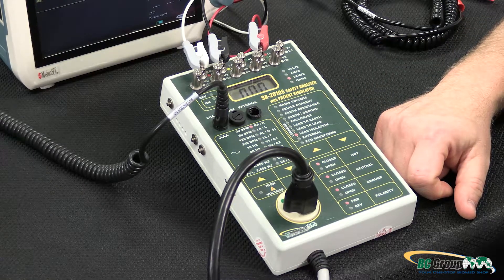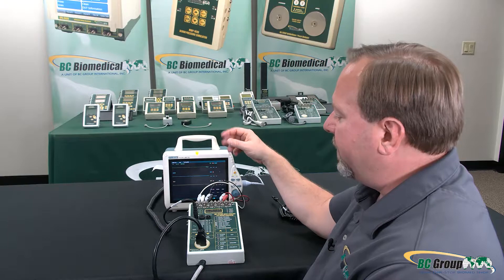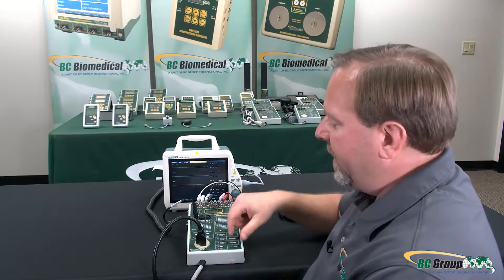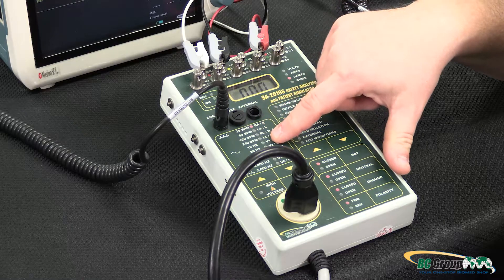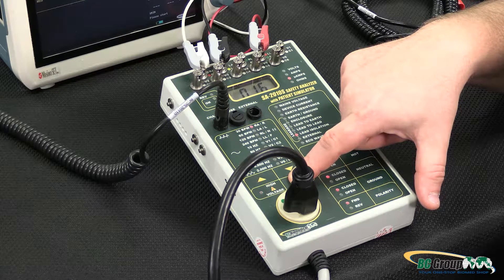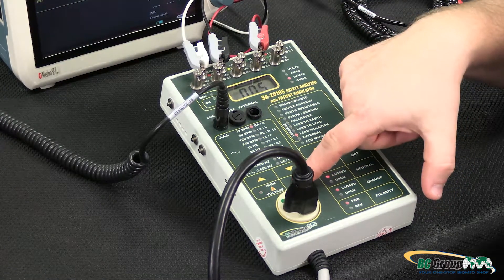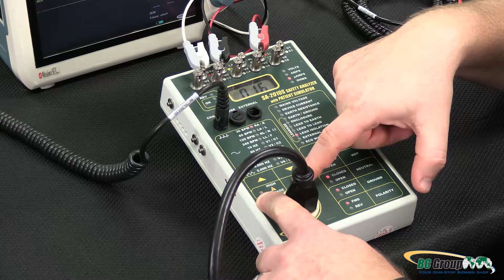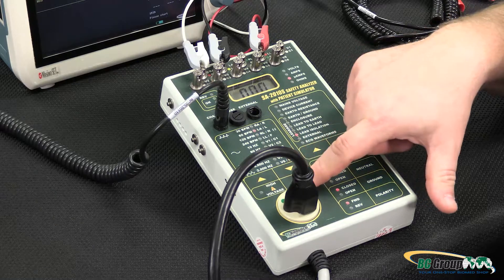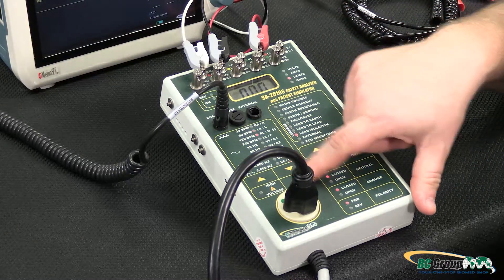Then lead isolation — that makes sure that if any one of these terminals somehow comes in contact with the hot lead, with line voltage, how much current would flow through the device and to the patient. We'll select any one of these leads and press the ISO test button. What this does is apply 110 percent of line voltage to the terminals. We have to hold down the button — we can see the high voltage present LED is blinking, telling us we are applying 110 percent of line voltage to those terminals. Then we can measure the leakage current flowing through that, and we can do that for each lead.